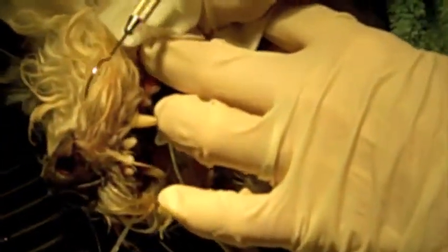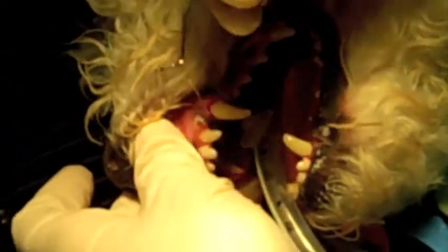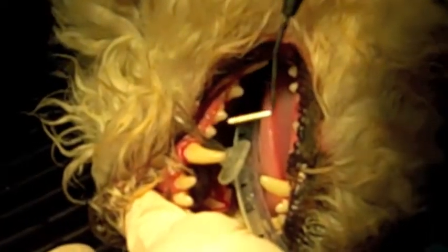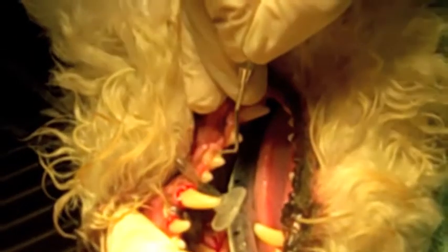Now everything's been cleaned. The next step in dentistry is to measure for gingival pockets around the teeth, or any loose teeth, any cavity regions, anything that's out of the ordinary. So one way to do that is to use this tool. I don't know how well you can see it, and that just measures the depth around the tooth. So you just go up along the gum line and make sure there's no pockets.